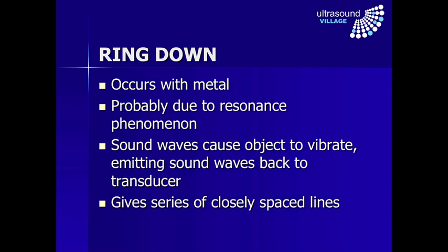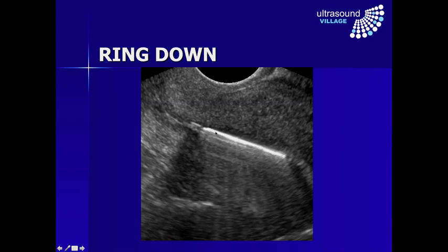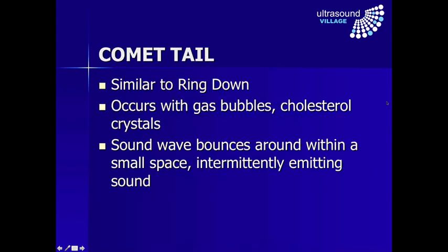Ring down artifact describes two situations. The classic situation is where you have a metallic object — it's thought that the ultrasound beam makes the metal start to vibrate, considered a resonance phenomenon. As the object vibrates it emits sound waves back to the transducer, giving a series of closely spaced parallel lines. Here for example is a metallic infusion device with lots of little parallel lines, and sometimes a little stream of very short parallel lines. A variation sometimes also referred to as ring down is the comet tail artifact — this occurs with gas bubbles and also cholesterol crystals.